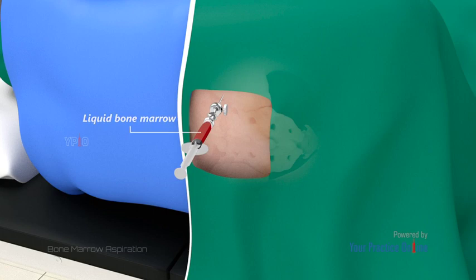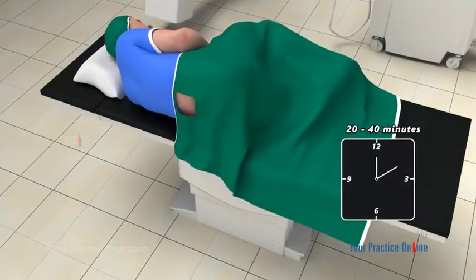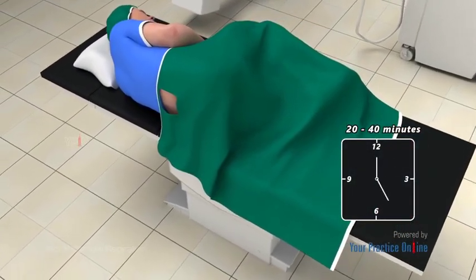You may experience a temporary sharp pain and then a pulling sensation as this is done. After aspiration is complete, a gauze will be used to apply pressure to the needle insertion site to stop any bleeding, and a bandage is placed. The entire procedure usually takes 20 to 40 minutes.